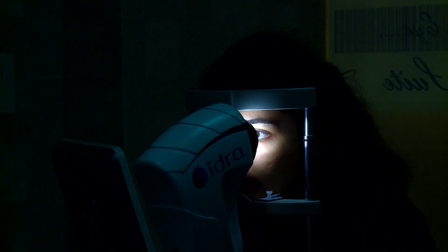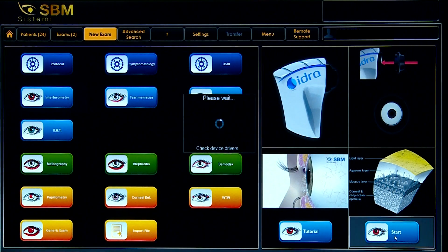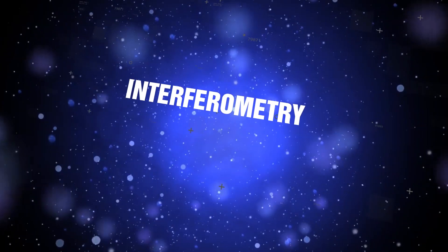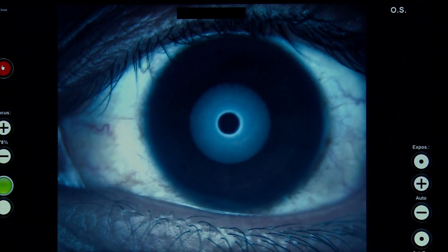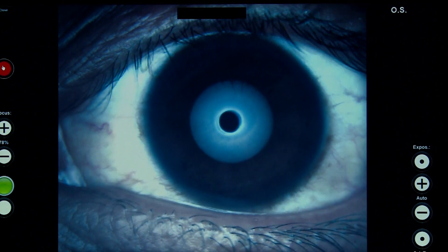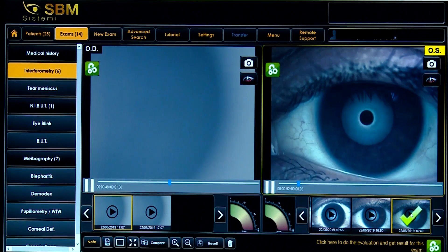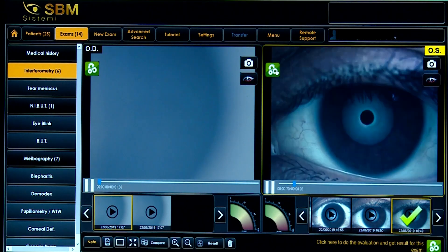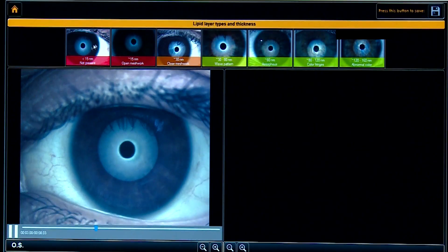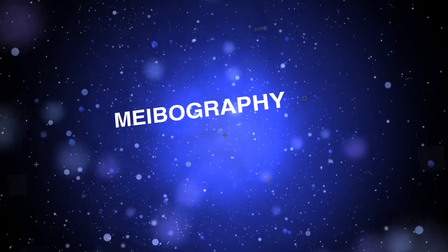Presenting IDRA Diagnostics. Using the interferometry feature, we can evaluate the quality and quantity of the lipid component of the tear film and compare it with the reference grading scale.